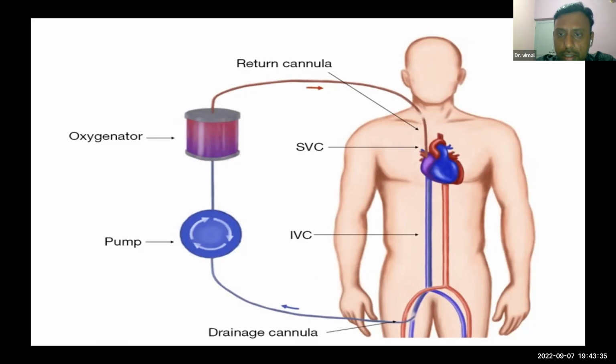So in order for the oxygenated blood to be delivered into the systemic circulation, we need to have non-compromised cardiac output or a normal cardiac output. So VV ECMO is predominantly in case of oxygenation and or ventilatory failure, wherein with the conventional mechanical ventilation, if it is not achievable to give a safe oxygen and carbon dioxide removal, then we need to consider this VV ECMO.